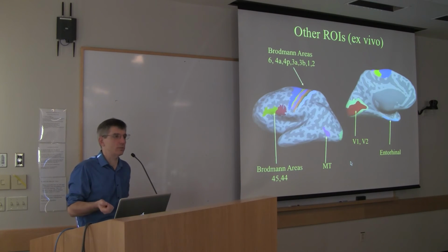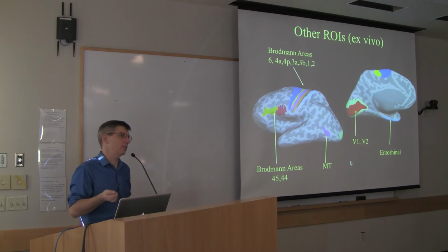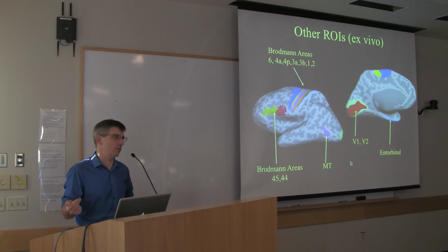So those exist as well, so you can do the same kind of thing, extracting out thickness or total surface area or total volume for these as well.